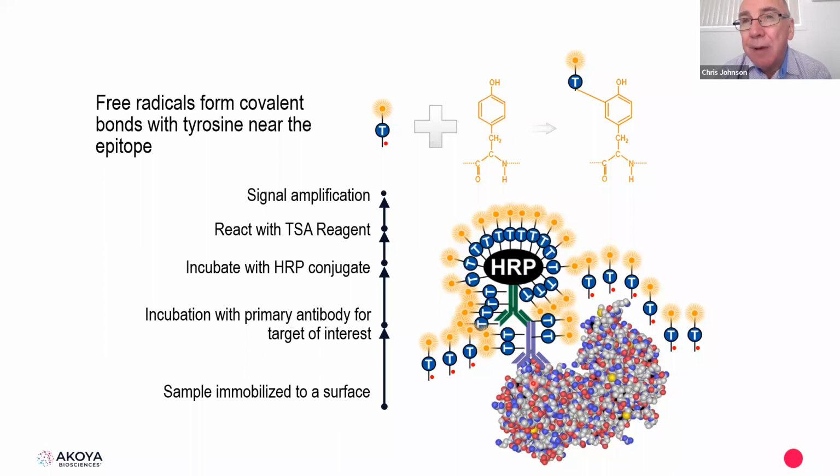So, if people have it accurately documented, then that's a very good start. And I would certainly recommend that there are many publications now using Opal. So if you're contemplating doing an assay involving Opal, then please read up on what other people have done. They will usually give indications of where they've placed their components. So that at least gives you a helping hand. And then you have to kind of try it out yourself.